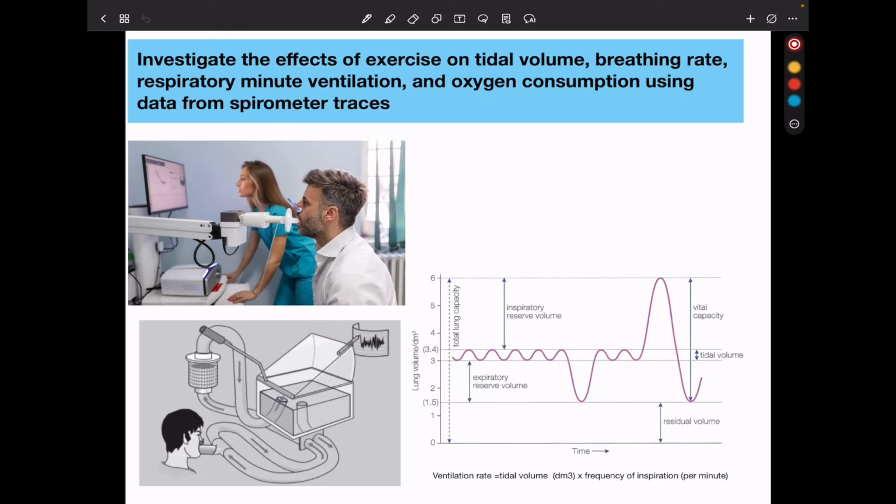The kymograph is going to be set to 1 millimeter per second, and then it's going to be turned on so that it can begin to rotate. Move the spirometer switch to the on or chamber position so they are able to take a full breath from the chamber. Then you record their normal breathing rate for about 1 minute. Then ask them to breathe out as deeply as they can for 1 breath. They should return to normal breathing for a minute.